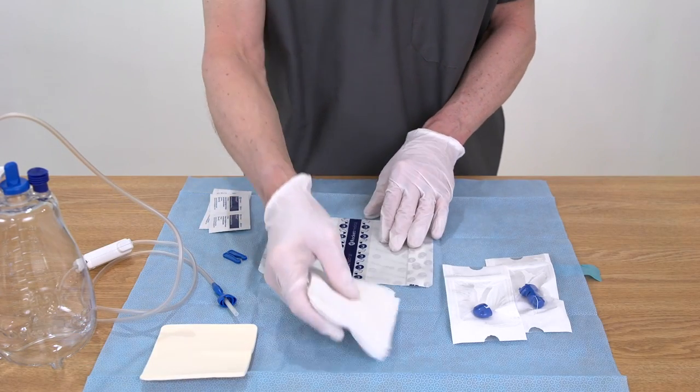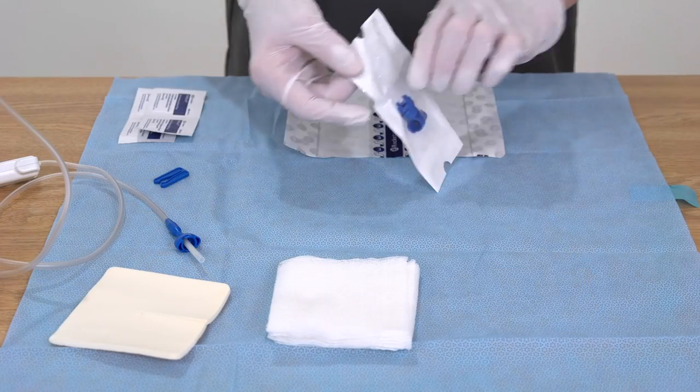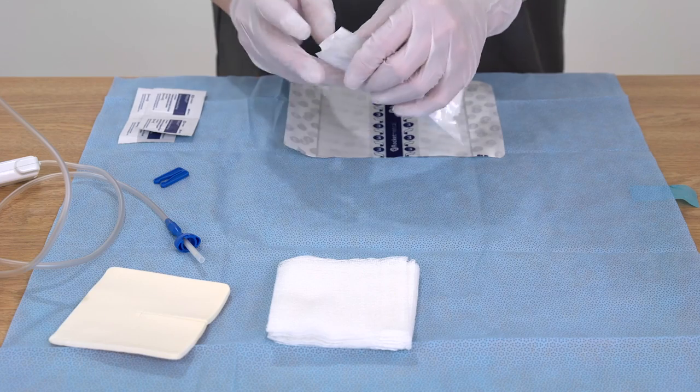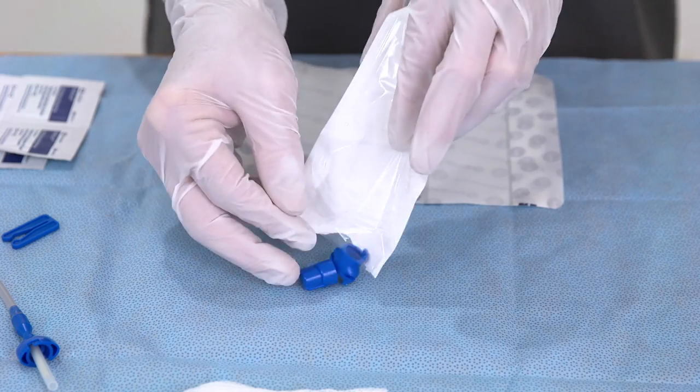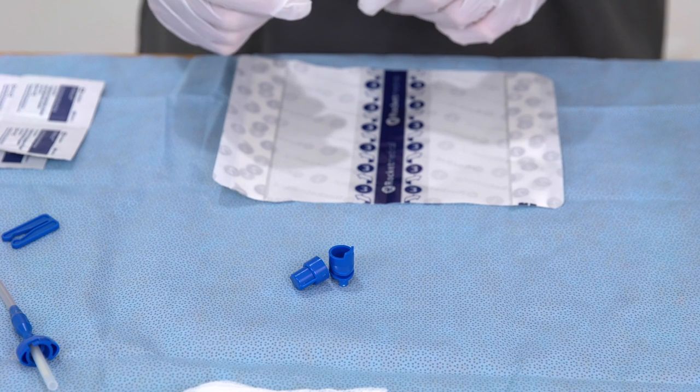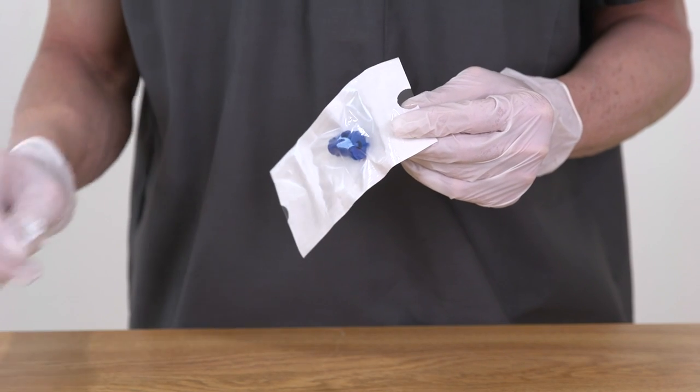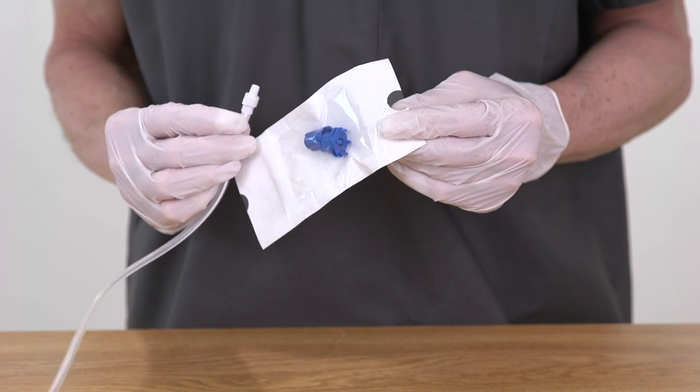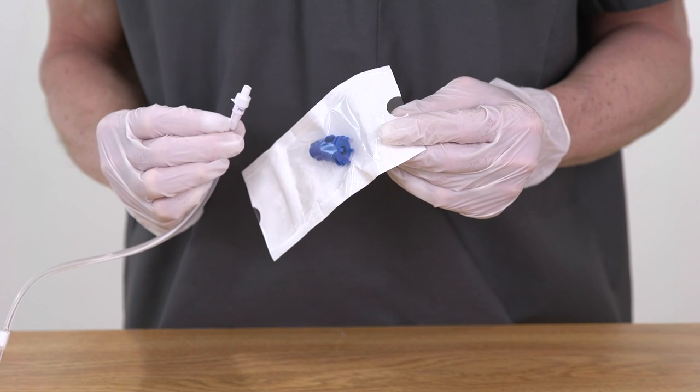Separate the contents for easier access. Peel open the packet containing the catheter cap and adapter and drop these into the center of the sterile field. Remember that the adapter will only be used if you are attaching the ROCKET IPC drainage kit to a catheter that looks like this.